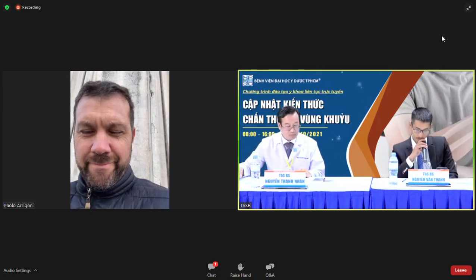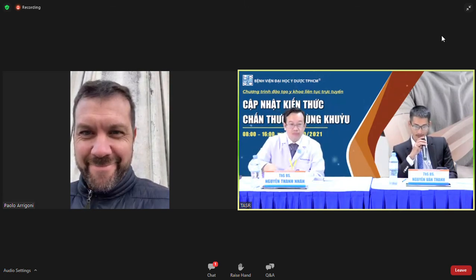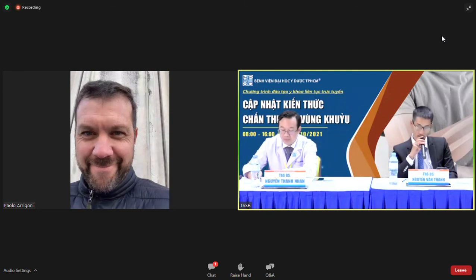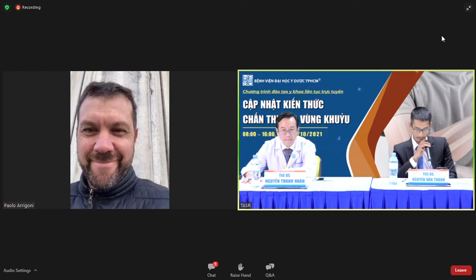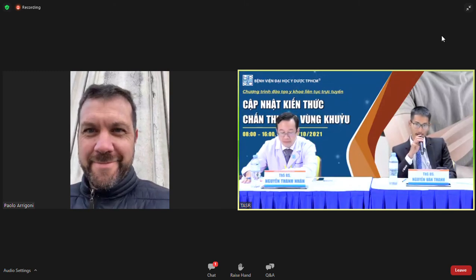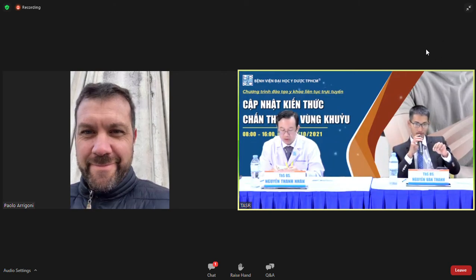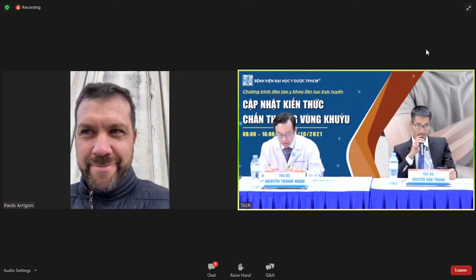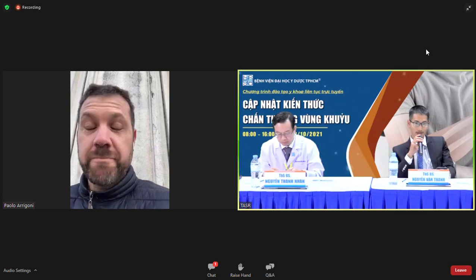Thank you, Dr. Paolo Angelo. You had a great presentation and shared your techniques for radial head fracture and radial head replacement. I had one question for you: how can you check the congruence when you put in the radial head? This means sizing, because when you check a radial head fracture, there are a lot of fragments.